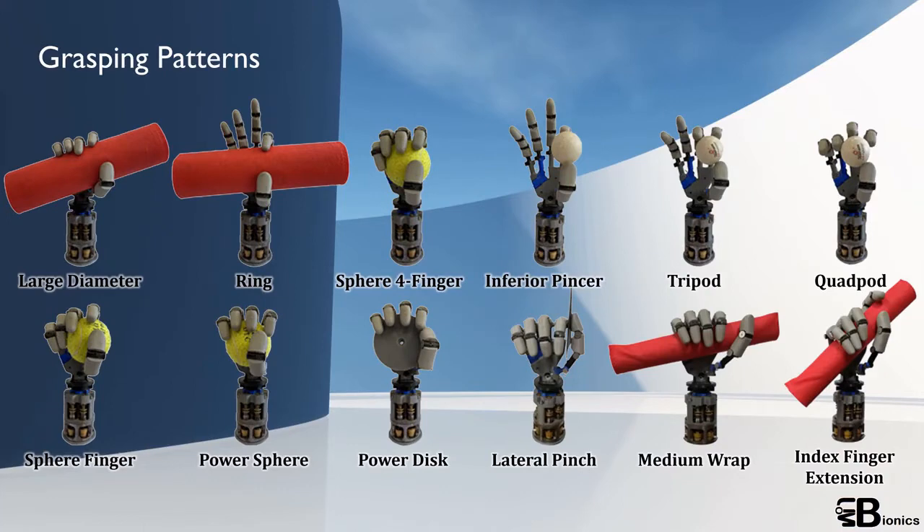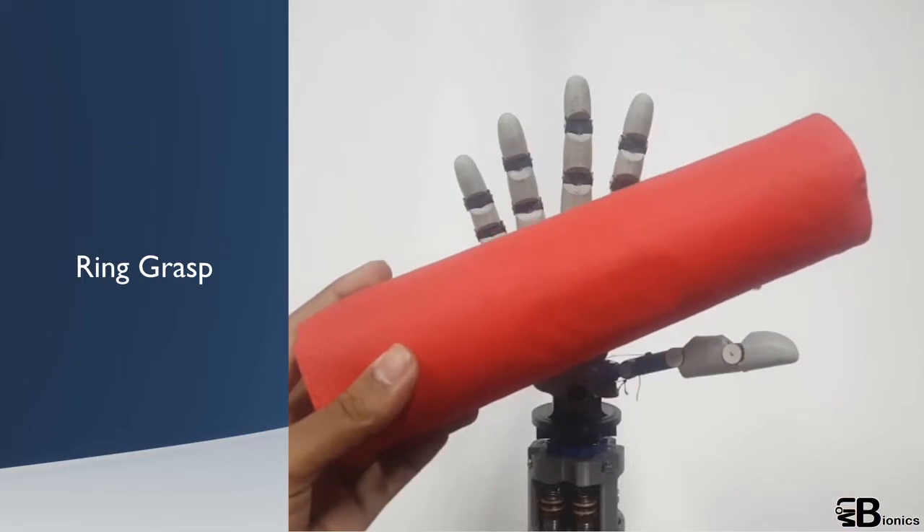This prosthetic hand can achieve 12 grasping patterns and can support performing more than 70% of day-to-day activities. Let's look at some of these grasping actions.